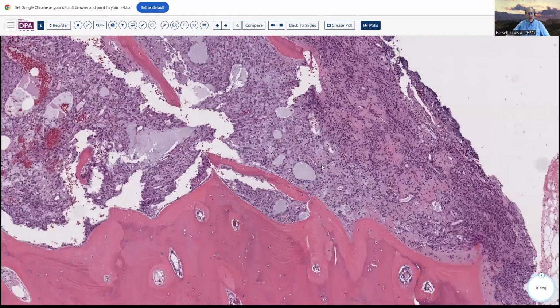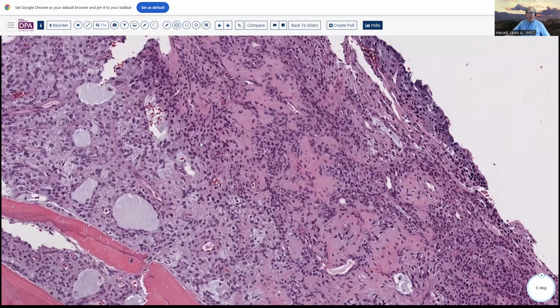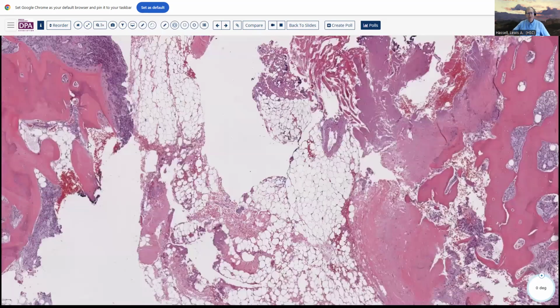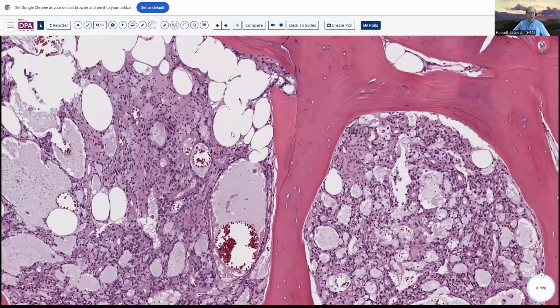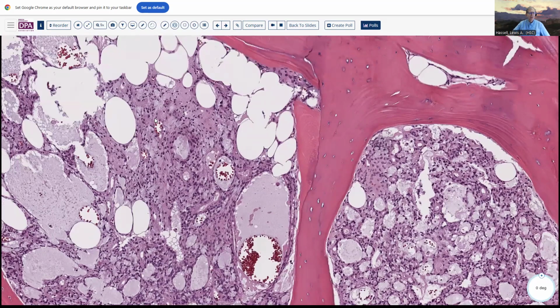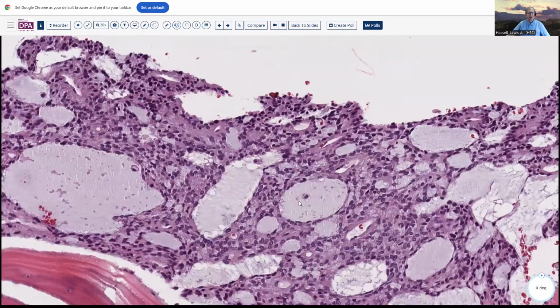It does have some areas of hyaline change, which, as you can see here, begin to resemble some of that osteoid-like matrix that we saw in our case. And you see here again. And also we have some elements of ectatic HPC-like vessels in a few areas. Here's one here, and here's one here that's sort of involving these cystic spaces, which are a bit more prominent. But notice here that we have very little in the way of the chondroid matrix other than this sort of microcystic pattern here.